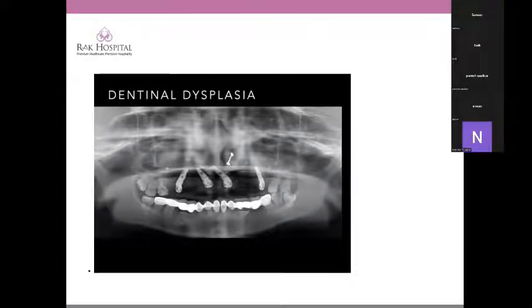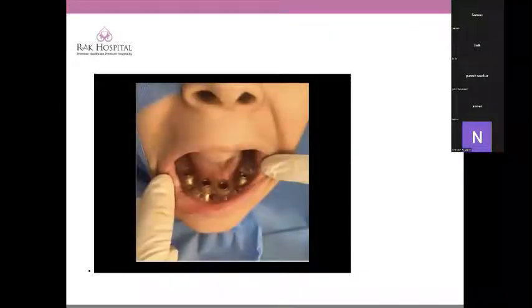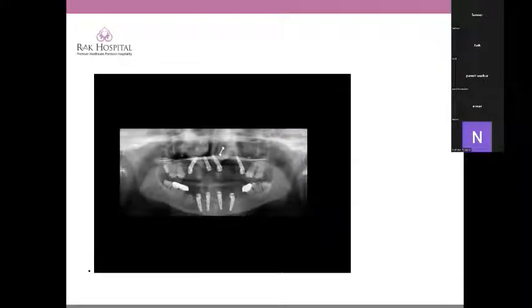If you can see the lower jaw, the patient had a canine which is in a sleeping position. So even this was done successfully after doing a CT guided surgery. This was the lower jaw. So the canine was removed. This is the guide, and these are the implants. Now these implants are in correct position because we have already planned our teeth position first, and then this patient is ready to be taken over by the restorative dentist to manage the bridge.